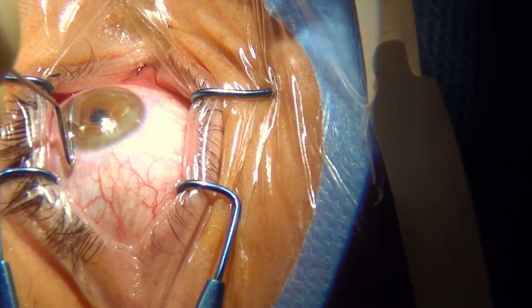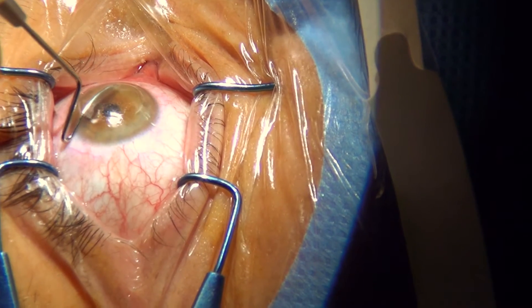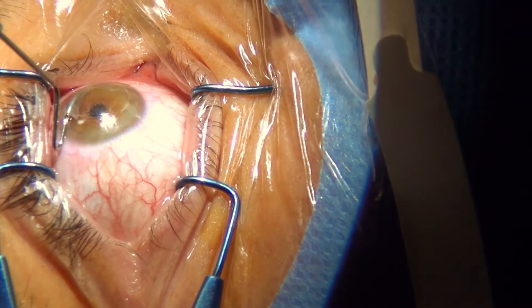From another viewpoint, the lenticule is brought to one side and removed without going into the pocket with the forceps.